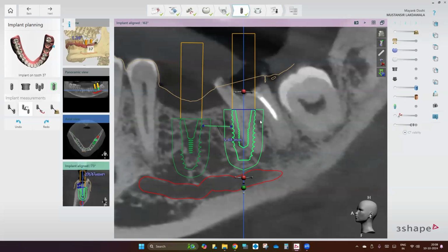But when you plan the osteotomy inside the furcation, तुमने तो पूरा फर्केशन खा लिया ना. A 4.5 millimeter drill, when it passes through the furcation, the entire furcation is gone. There is no furcation left anymore. Do you get my point?